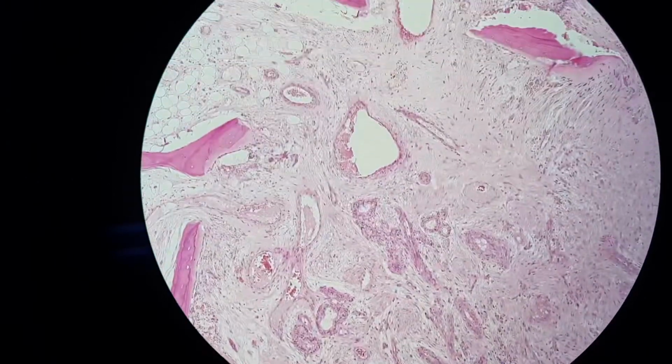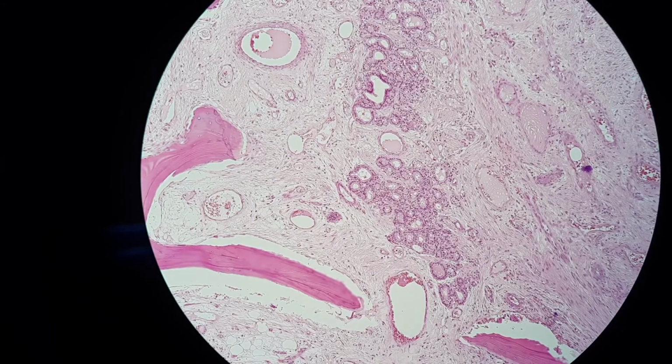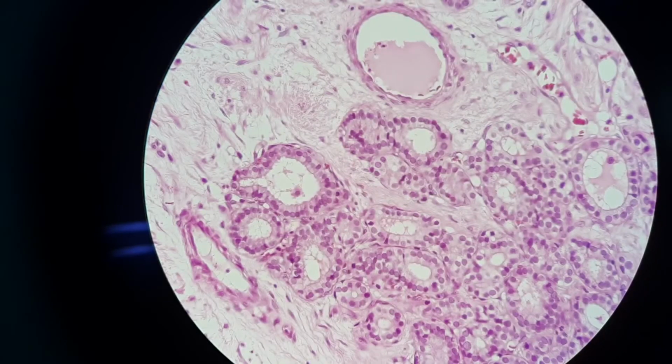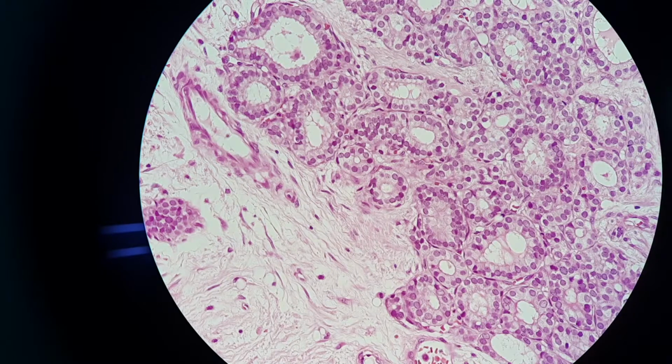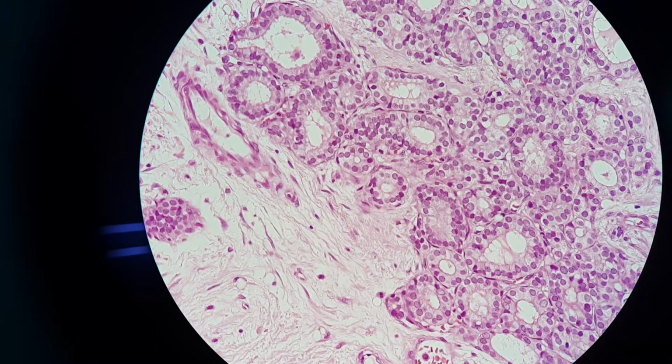So what type of thyroid carcinoma might this patient have? It could be a follicular carcinoma type, because you see the nucleus is somewhat round in shape. It does not have any nuclear inclusions or prominent nuclear grooving, or any features that suggest a papillary thyroid carcinoma. So it's still a well differentiated thyroid carcinoma, in this case of the thyroid follicular cells.